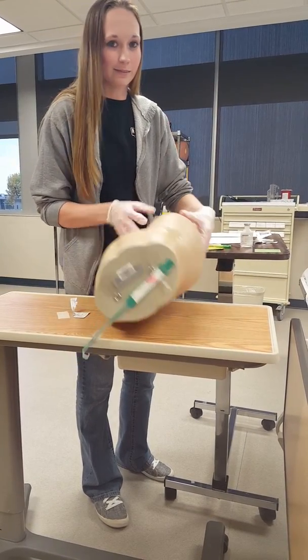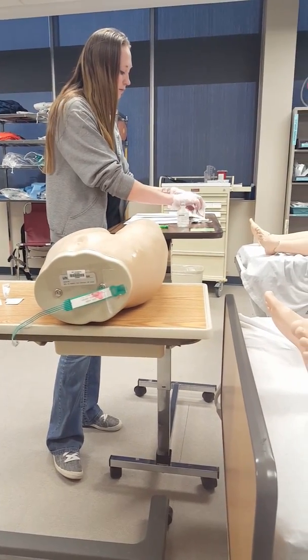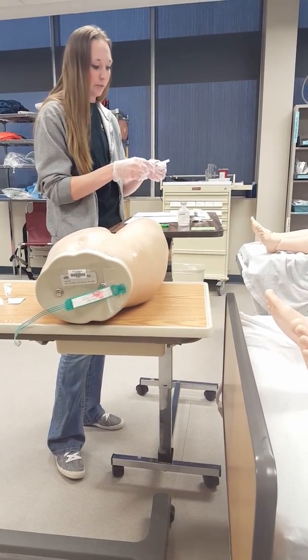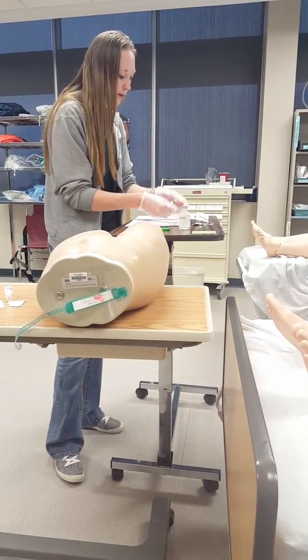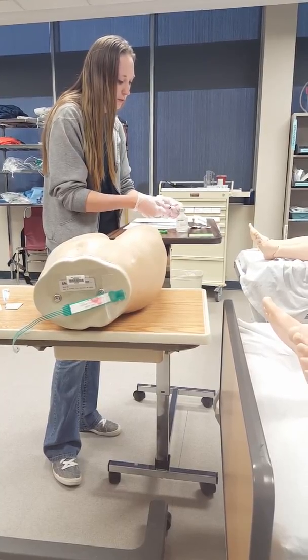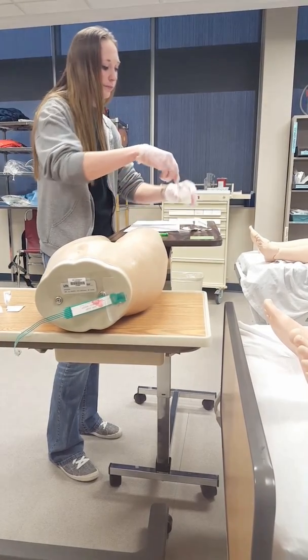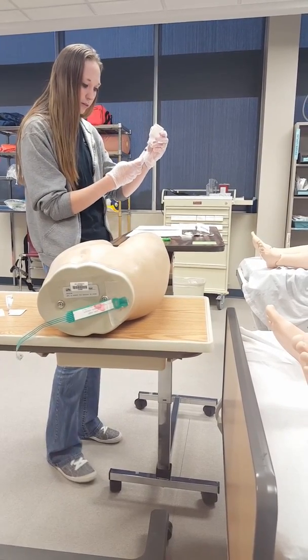I'm gonna have to lay it down for a second. Okay, and then I would take this one off and put it on my sterile field. Put it back in there, because I'll use that after. And this one's to draw up. Screw that on. Hook this into my vial. Lift it up.